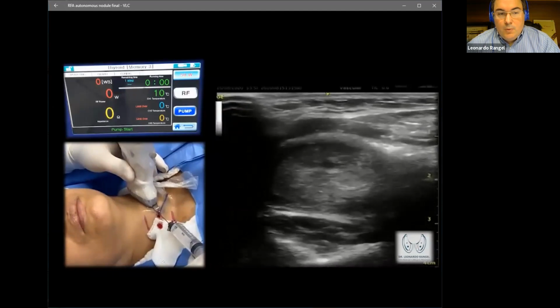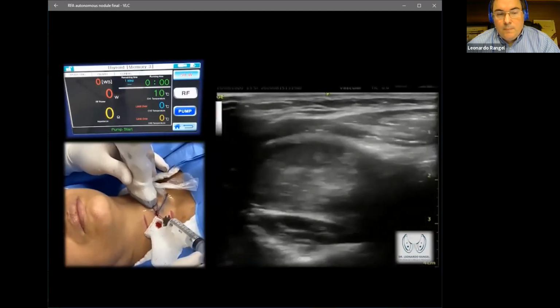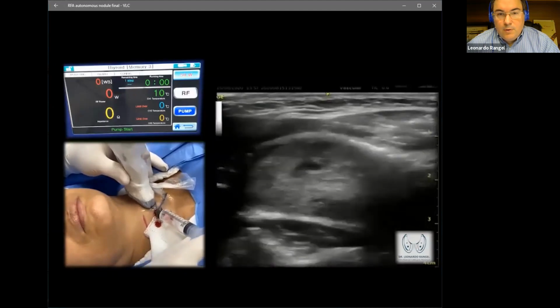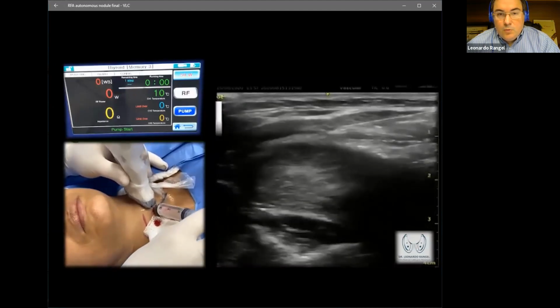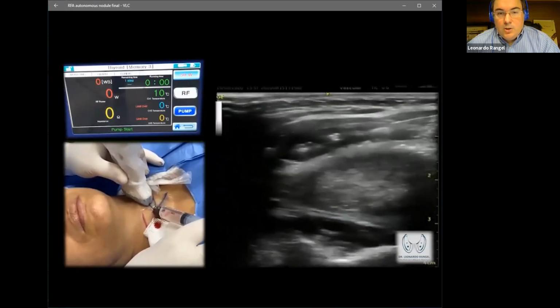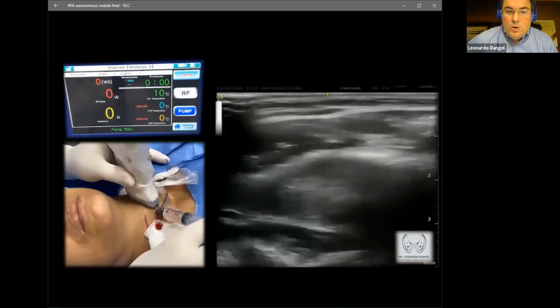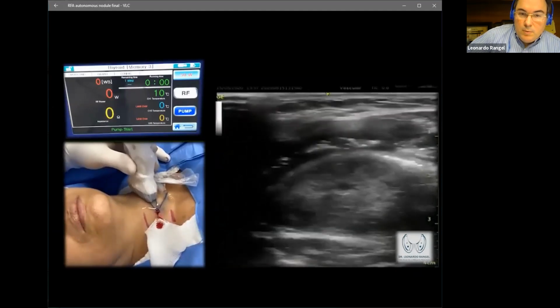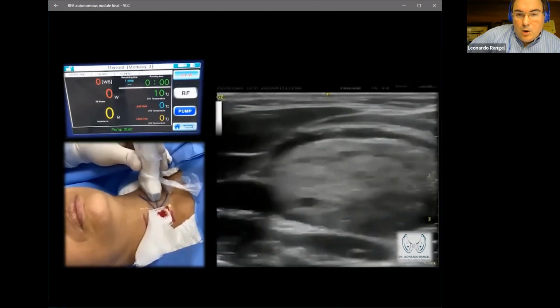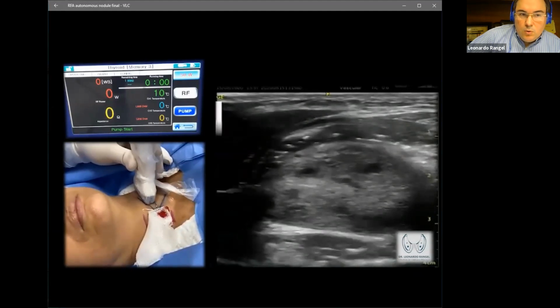After we finish the area over the thyroid just with the lidocaine, we will move to the D5W when we go over the carotid. So here we are finalizing just the area over the thyroid nodule. We need to go with the D5W generally with larger nodules that are in contact with the carotid. Those large nodules, we definitely would need to go over there.